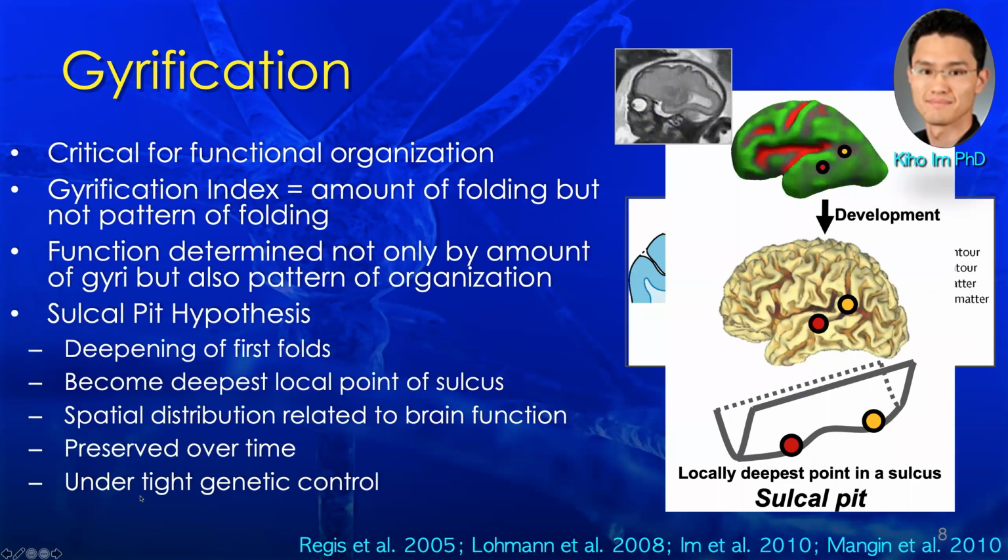And to show you how this works in clinical practice, here's an example of two fetuses that were scanned on the clinical service at 25 weeks gestational age. The similarity index to our atlas of normal was more than 80%, or slightly close to 80% here in the top one, but less than 78% here on the bottom fetus. So the top one was much more similar to normal than the bottom.